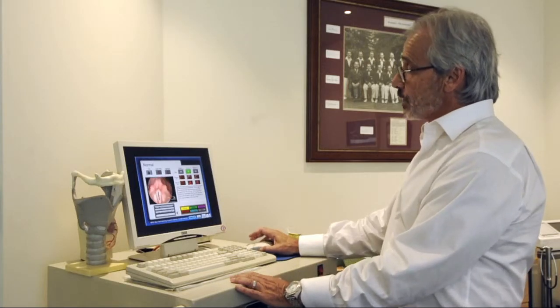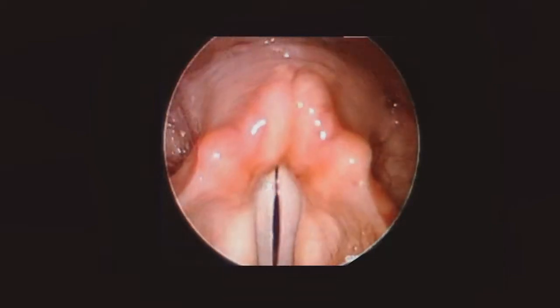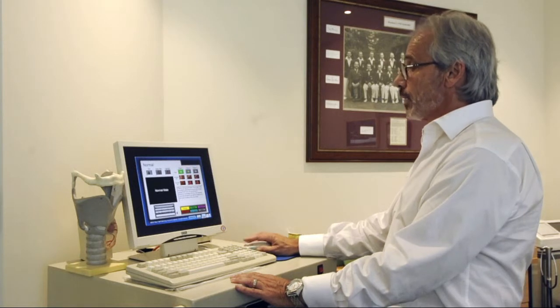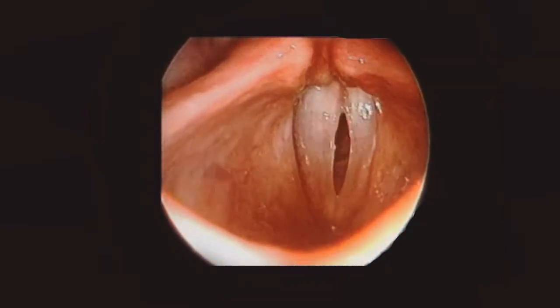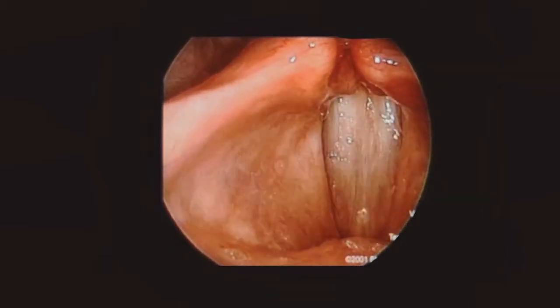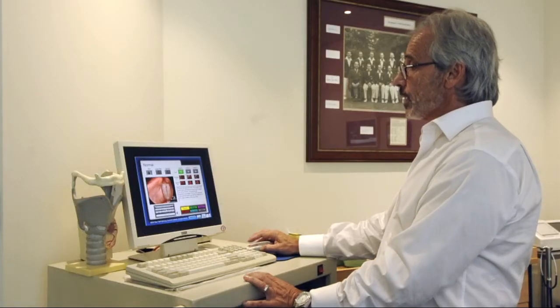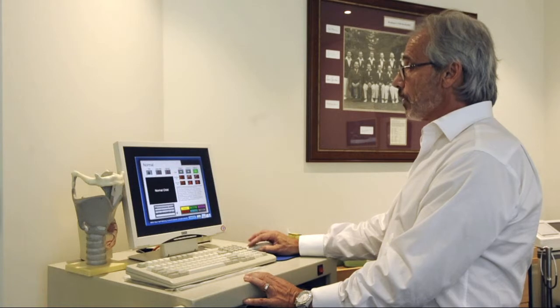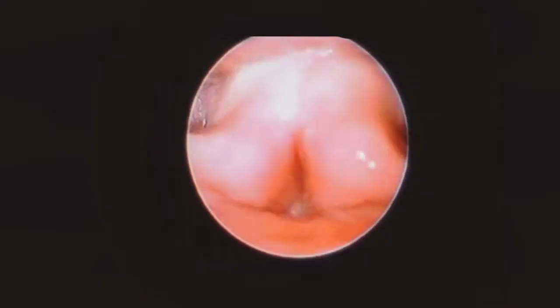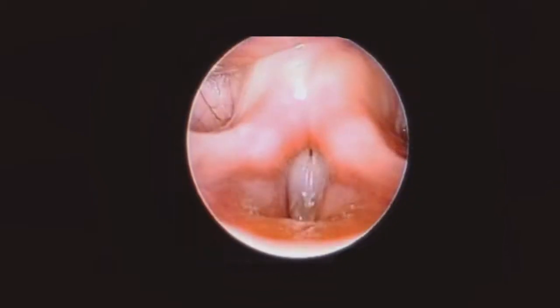This is a normal female larynx taken with a rigid telescope using stroboscopic or high speed imaging to look at the movement of the vocal cords in slow motion. This is a similar picture of a normal male and you can see the lining over the vocal folds of the muscles vibrating over the muscle — this modulates the column of air and generates sound. This third video is a normal child. You can see how the larynx is much shorter and the vocal folds are finer, but the procedure is tolerated in children over the age of five as a rule of thumb.